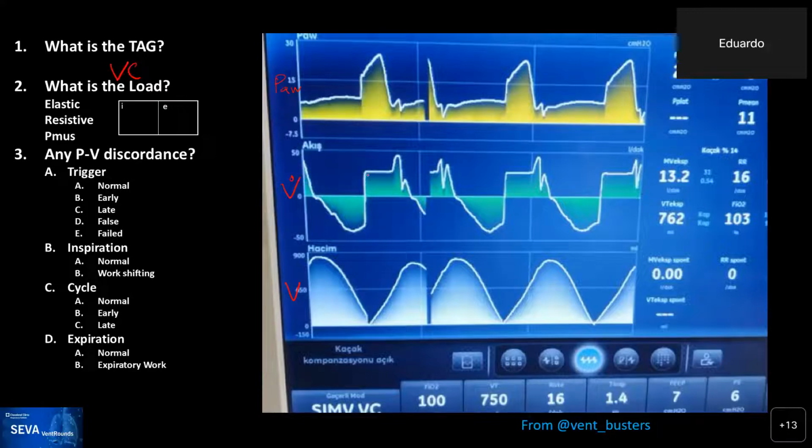So you can see the breath, how the flow is constant. But then there's this irregularity at the end of the waveform, which is atypical. But regardless, at the beginning of the flow, there is definitely control.